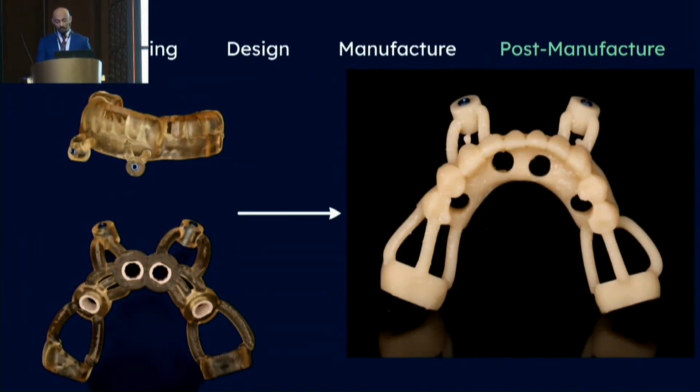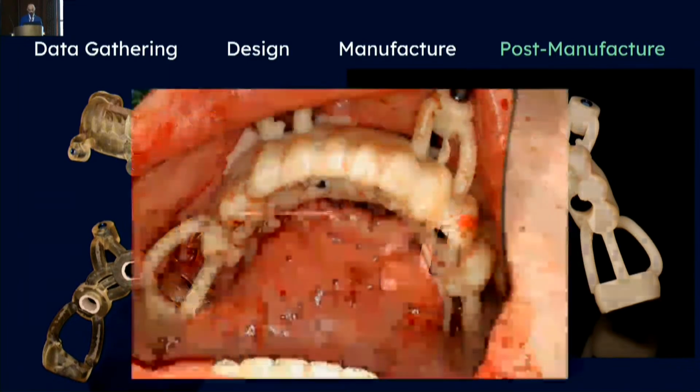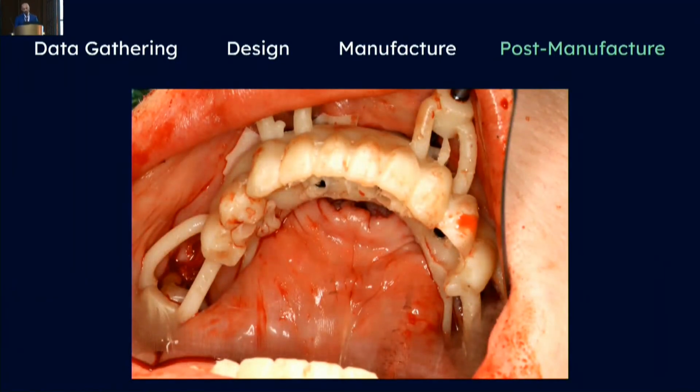For the mandible, immediate loading was also a goal, but this time, all her mandibular dentition was to be extracted except for the most distal molars, which were strategically used to support the implant's guide and immediate load prosthesis. They were extracted after the loading of the implants had been completed. Also, luckily, enough initial implant placement torque was achieved for loading purposes, and so implant loading was achieved as described.